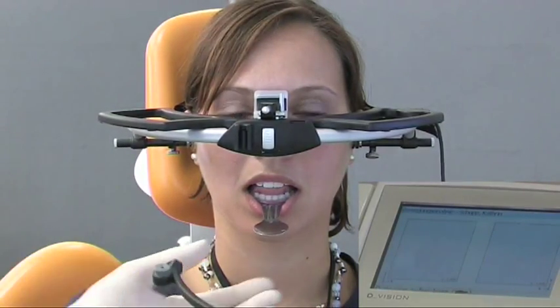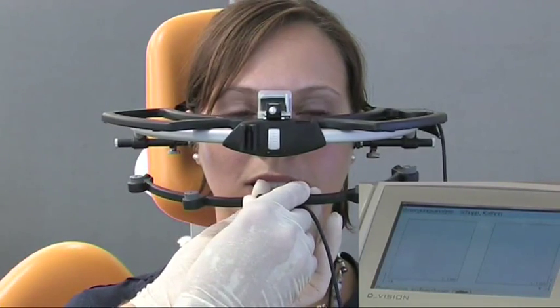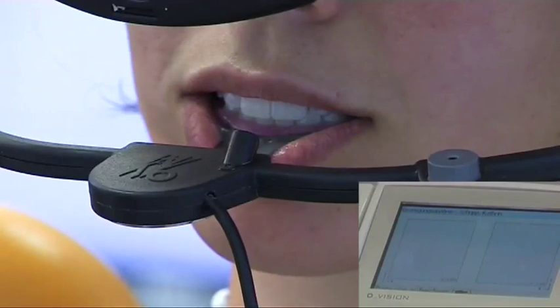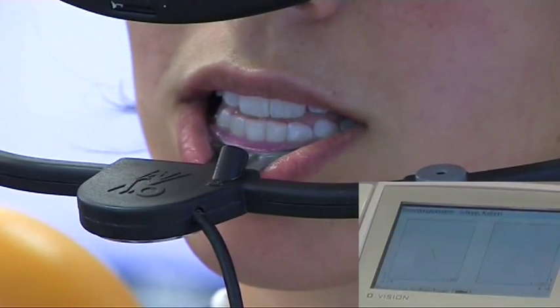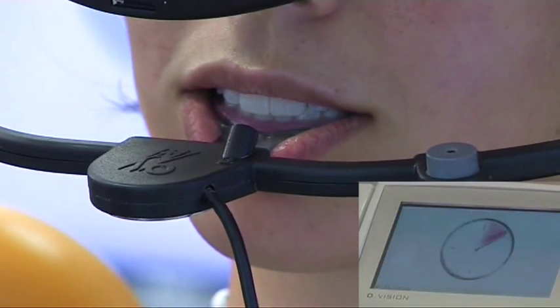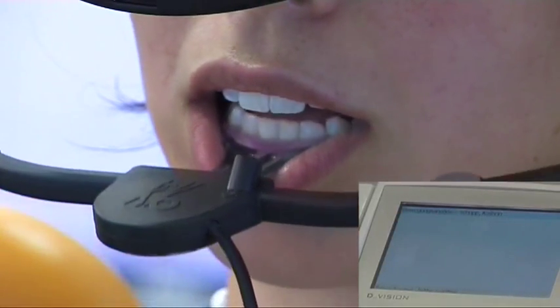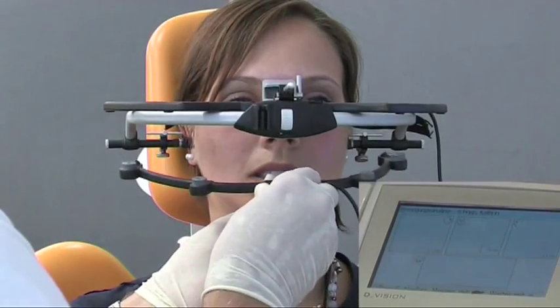Please bite down again. The measuring bow is put back again onto the paraocclusal spoon. With maximal intercuspidation, the patient executes a protrusion movement which is then recorded. She bites down again and an opening movement is recorded. From these two recordings, DIGMA calculates the kinematic axis point.